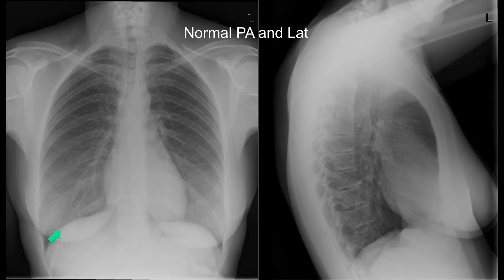The diaphragm is visible because the interface between the diaphragm and the aerated lung above and the solid organs below creates contrast. Note that you don't see the diaphragm where the heart sits on it — it just comes into view on the left side.